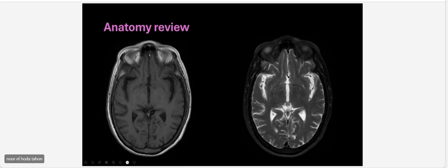And here, you may say, oh, it is phased here a little bit, and here it's wider. That's fine, because maybe there is some white matter atrophy or something that takes its place, or it's a normal variant. So we can expect something like this. Nothing wrong about it.